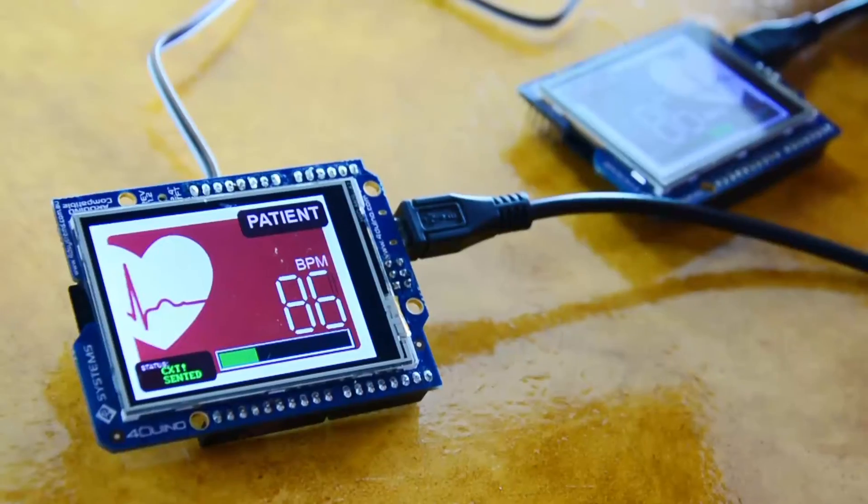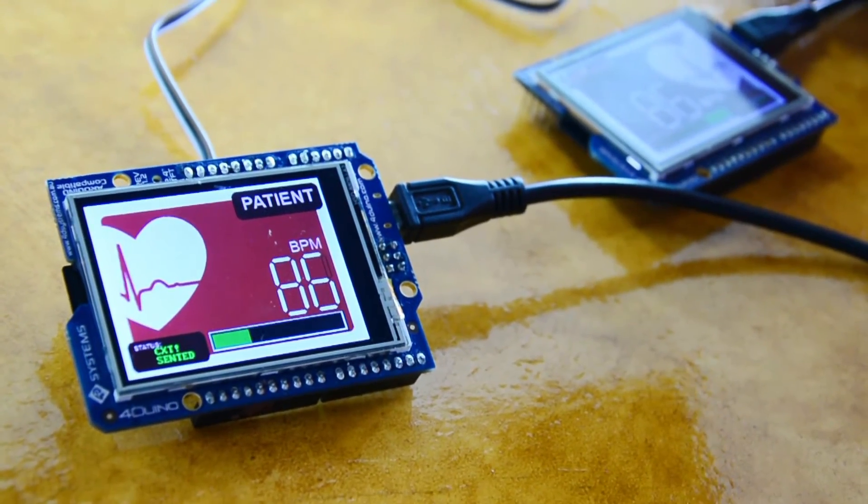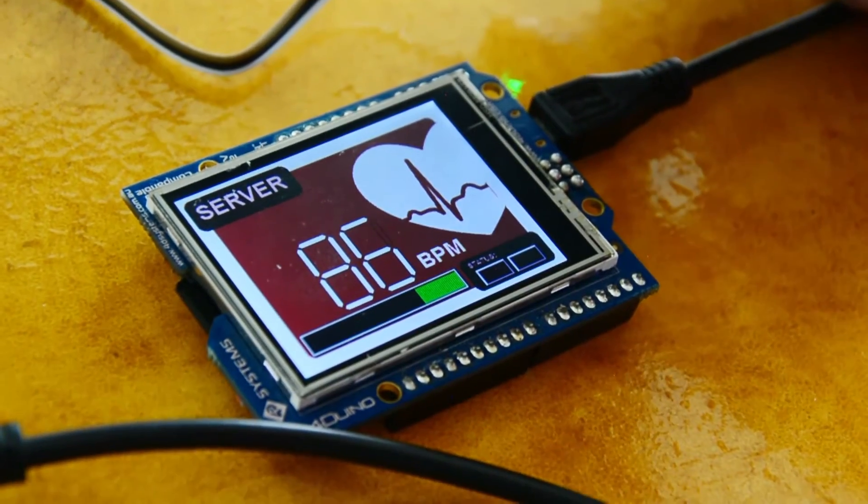Welcome to another episode of 4DProjectTutorials. For this episode, we will be building a FORDUINO Pulse Rate Monitor System.